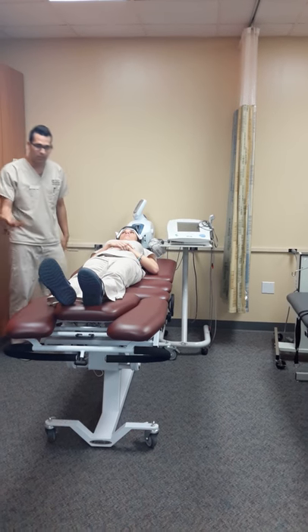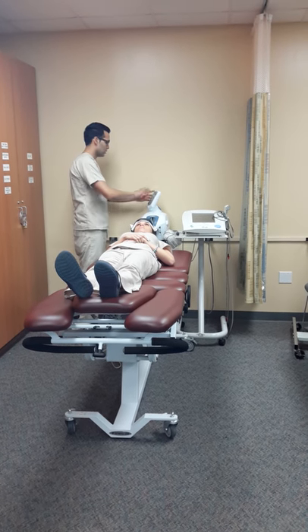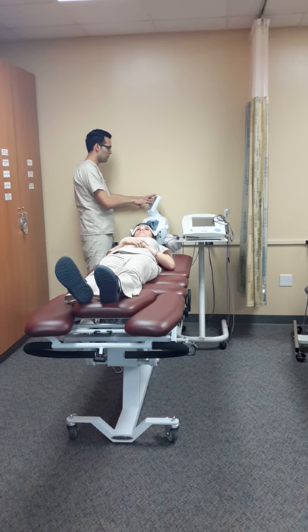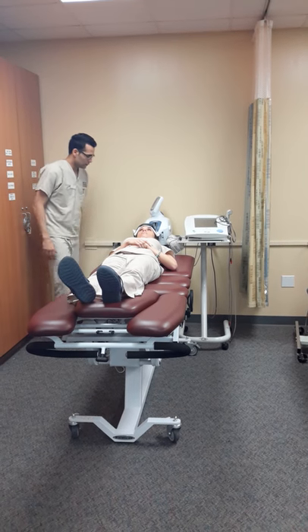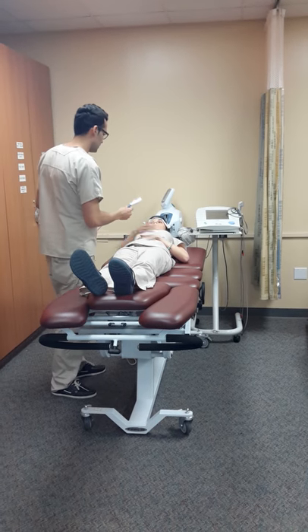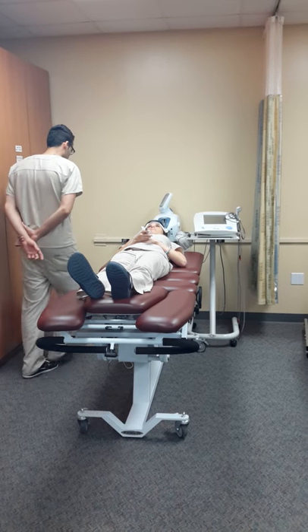Now I'm going to set up all the parameters. I'm going to use static traction — static traction at 25 pounds of force with 25 minutes of treatment. Before we continue, I'm going to introduce you to the magic button. So in case something is bothering you, just press the button and it's going to stop the machine. Okay, we're going to start.